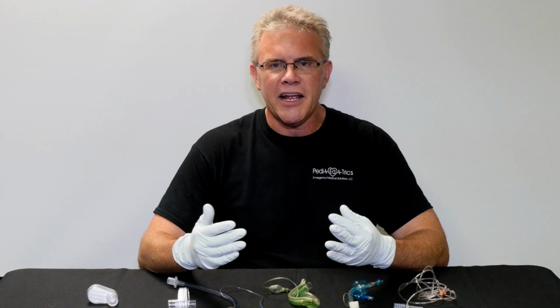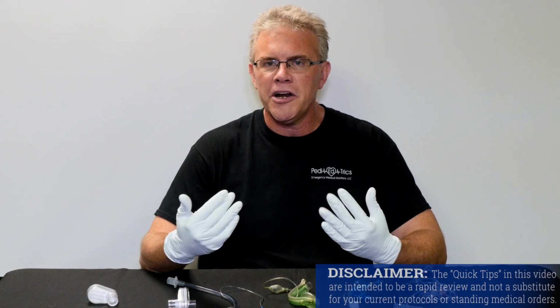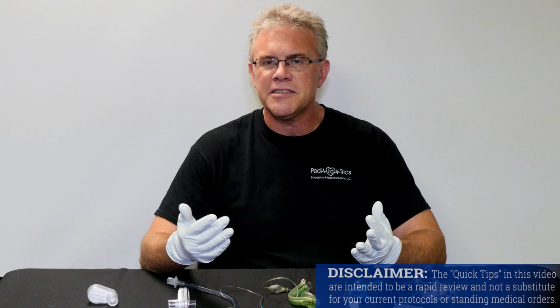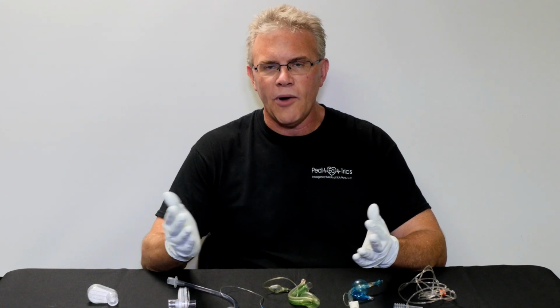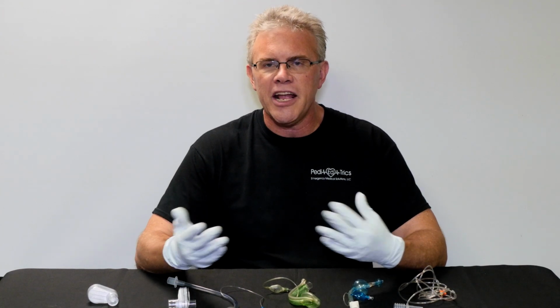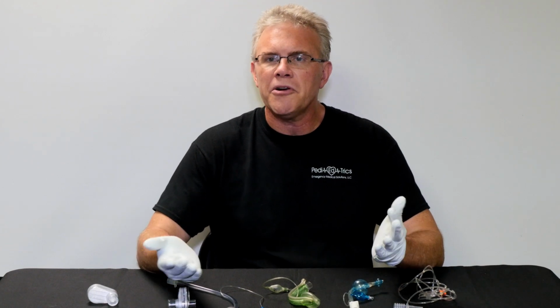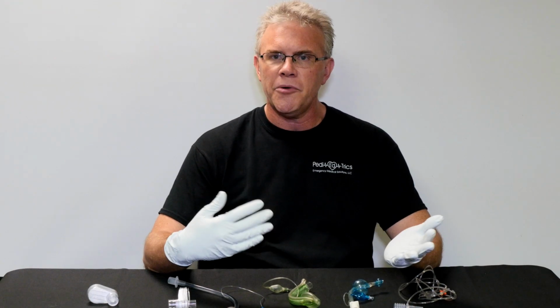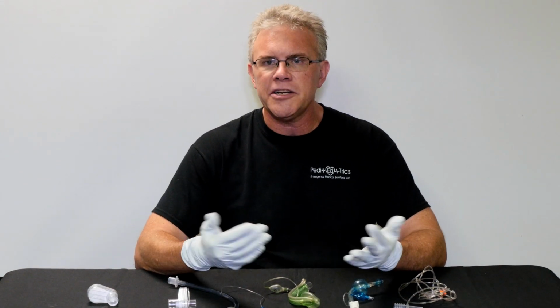So with that in mind, for seemingly countless years in anesthesia, remember the standard has been that if you put in a tube, you have to verify that it's in the right spot. And that's not only by listening to breath sounds, listening to their belly, that's great, but more importantly, for countless years in anesthesia, some variation of carbon dioxide is where it's at. Because remember, whether you're a baby or a big person, you inhale oxygen, you exhale CO2. So with that in mind, a couple quick things that I just want to touch on.